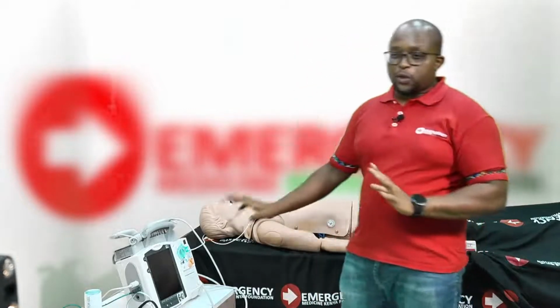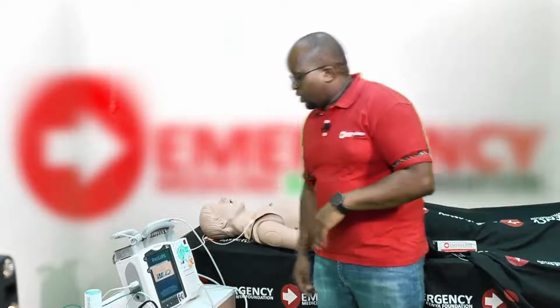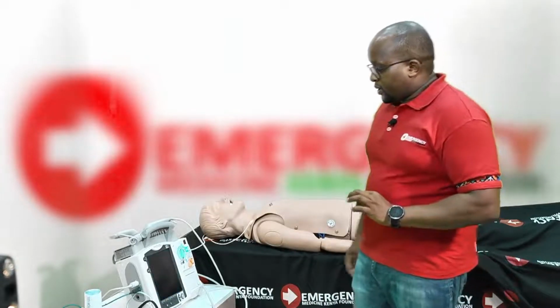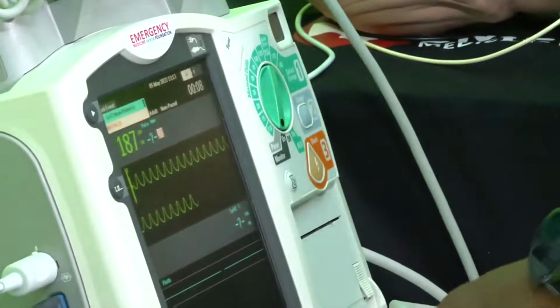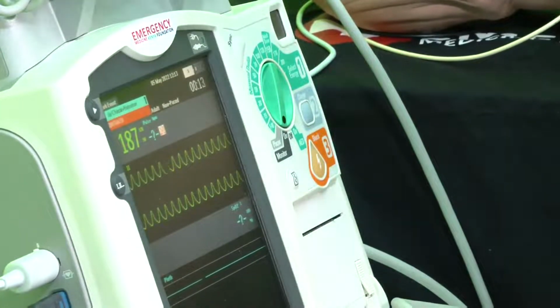Now, the other rhythm I just want to show you that your patient could potentially have, that is a shockable rhythm, is what we call pulseless ventricular tachycardia. So as you can see it on my screen there. Now, this rhythm is shockable if your patient, let me just mute that a bit, has no pulse. So I will check quickly, is there a pulse? And you should not spend so much time.